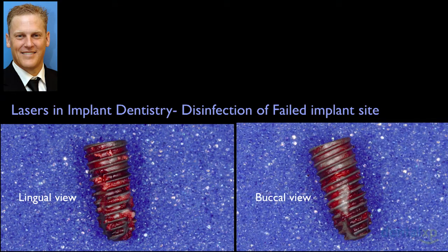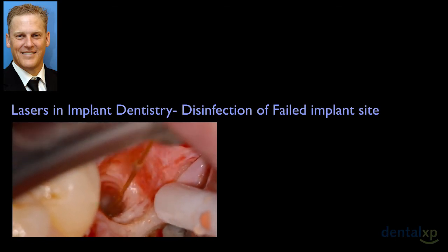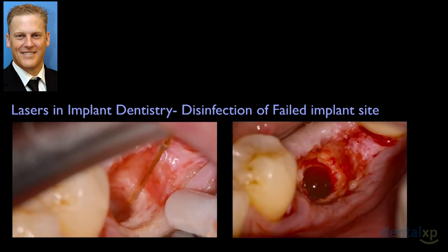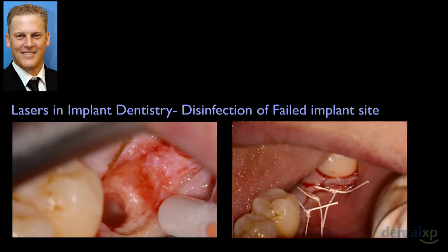And look how clean the threads are on the buccal. This was just a minute or 2 minutes of use with the laser. The patient decided they just wanted to have it disinfected, so we did this with a radially firing tip. And then after disinfecting, she said, "I don't want any grafting, I don't want to pay for anything else." We just applied a collagen sponge into the site and closed it up.